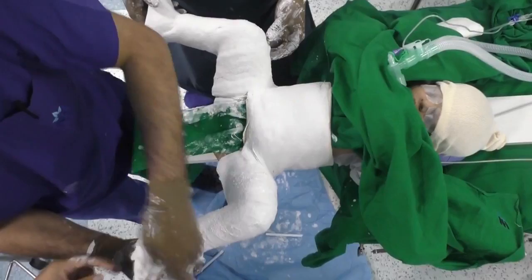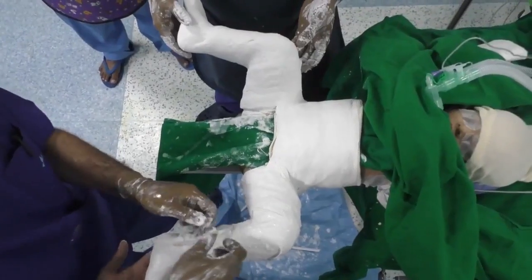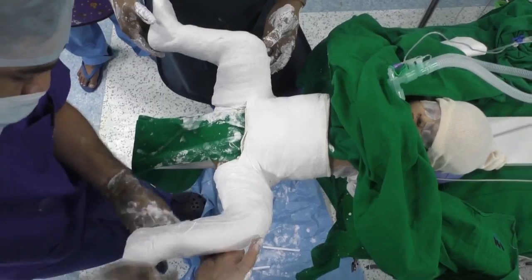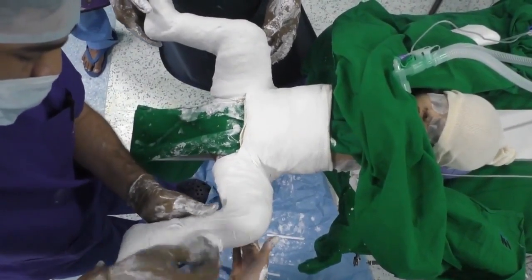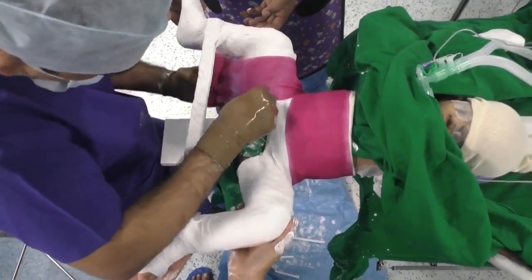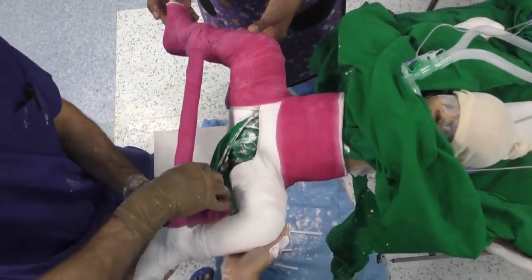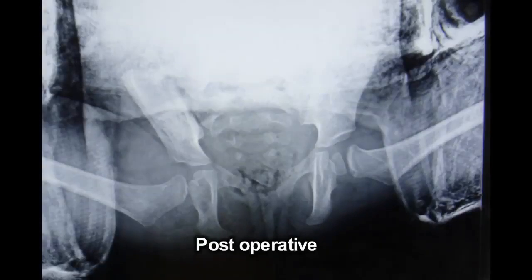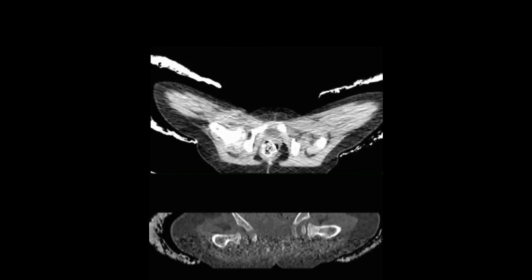We are now extending the spica beyond the knees and onto the ankle and foot. It is important to mould the spica well and to make sure the edges will not hurt. The comfort of the child is very important. We have applied the bar, and finally we are applying a layer of fiberglass plaster over the cast so that it doesn't get soiled. This makes the plaster lighter in weight and increases its durability. Post-operative X-rays confirm that this is a concentric, stable reduction. Sometimes we do a limited CT scan to confirm this in the post-operative period.